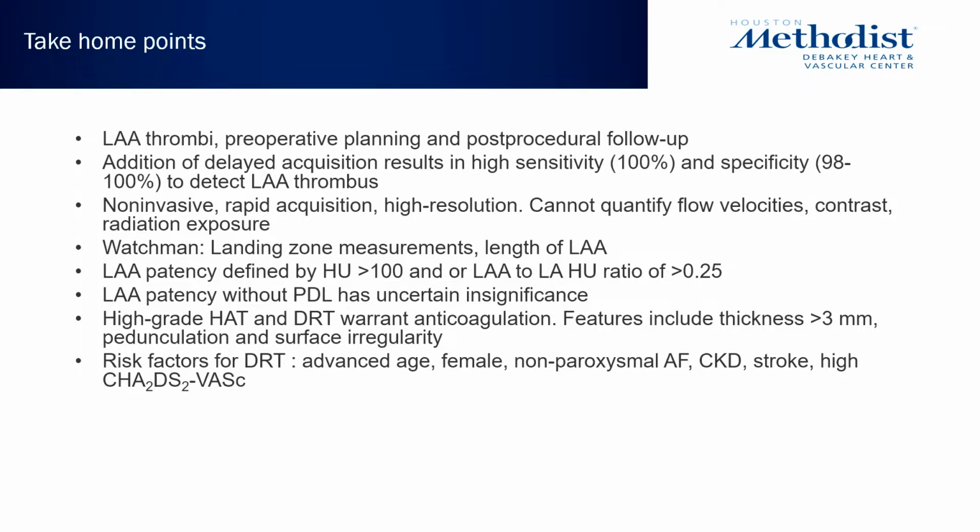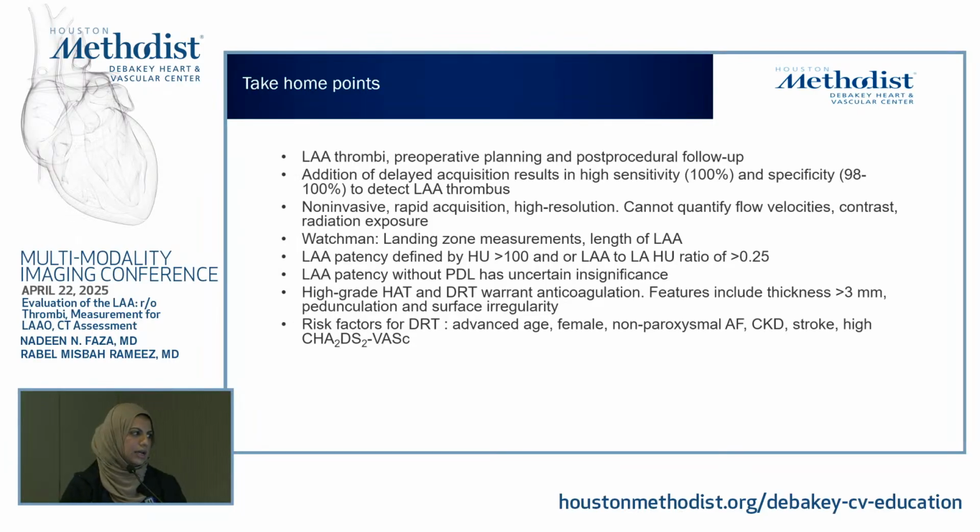Okay, so these are kind of my take-home points. CT can be very helpful in the pre-procedural space, the post-procedural follow-up, and then also in the intraprocedural space. Really the importance of that delayed acquisition. Different centers will do it differently, but the importance of delayed imaging needs to be underscored. It's non-invasive, rapid, provides high-resolution images, but obviously we're giving contrast, there's radiation.